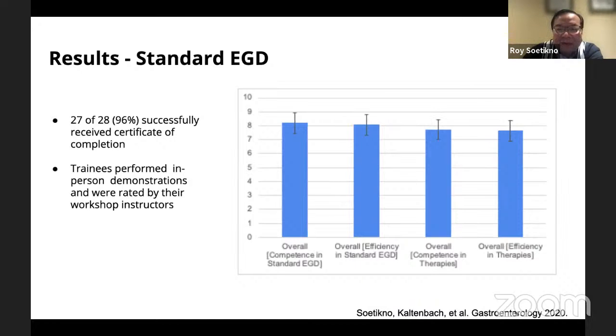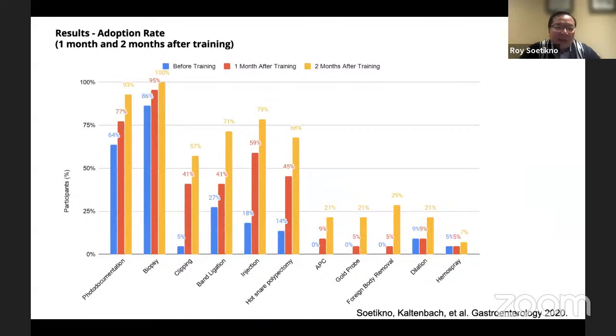So in a mastery course, the typical passing is about 97% or so. And here, almost everyone passed in the first trial of the summative assessment. When we followed them over time, they actually perform a lot more of a therapeutic procedure faster.